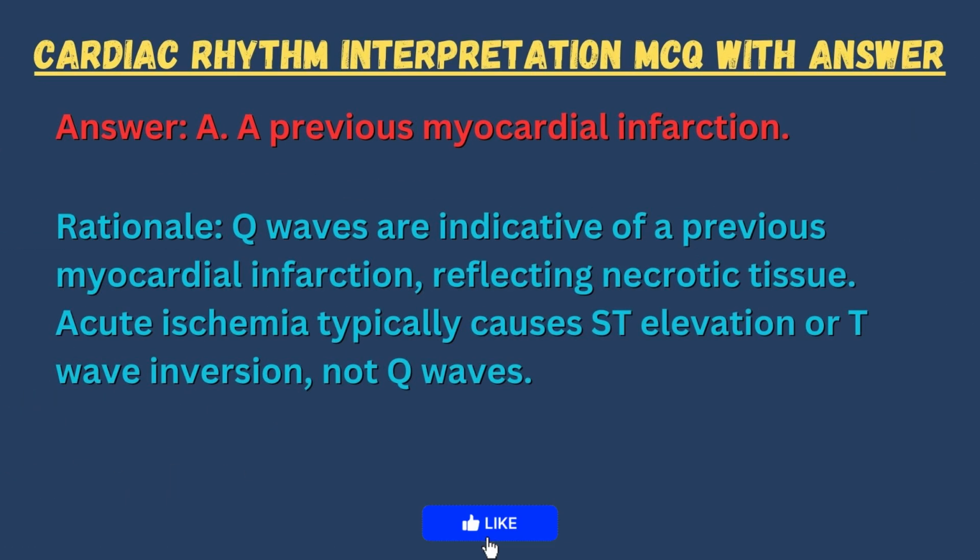Answer: A. A previous myocardial infarction. Rationale: Q waves are indicative of a previous myocardial infarction, reflecting necrotic tissue. Acute ischemia typically causes ST elevation or T wave inversion, not Q waves.